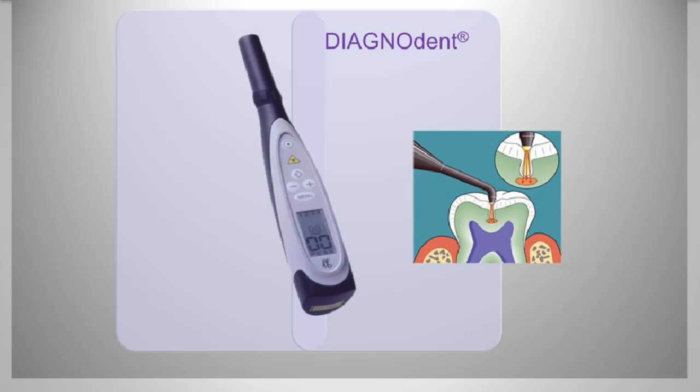And then we made a big step with the Diagnodent. This is probably one of the more recent models, the Diagnodent pen. I honestly can't remember when the Diagnodent came out. Maybe it's been 10 years, maybe longer, I'm not quite sure, but the product has evolved. This really helped us because all of a sudden we had this laser-assisted diode to help us find that decay underneath the occlusal surfaces, where the fluoride-rich enamel was eluding us with the Explorer. So that was really good.